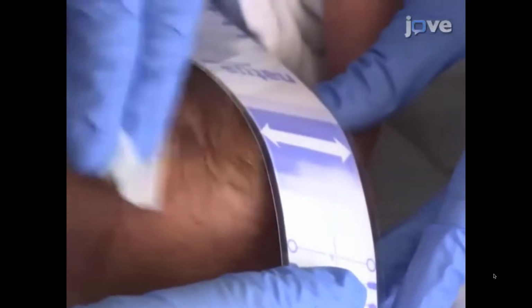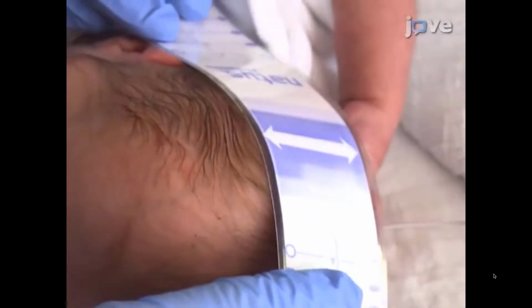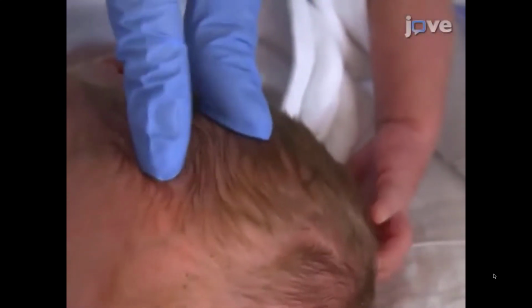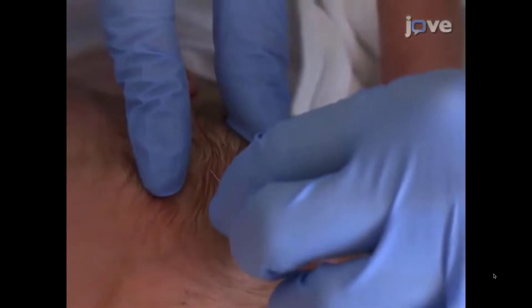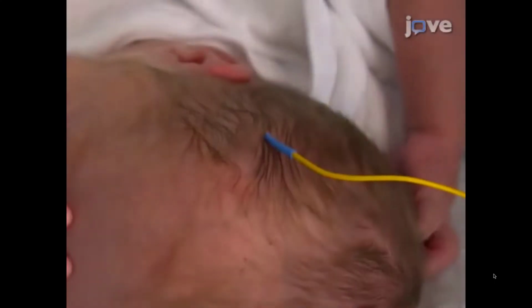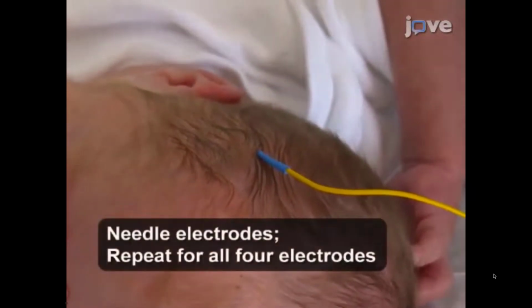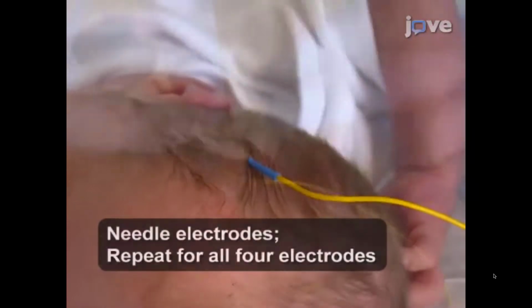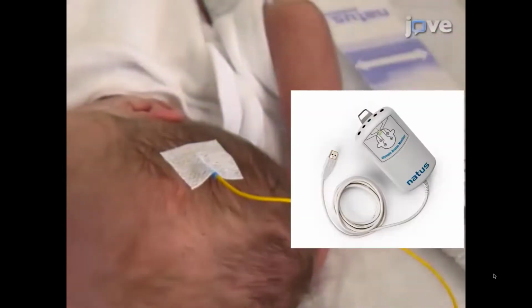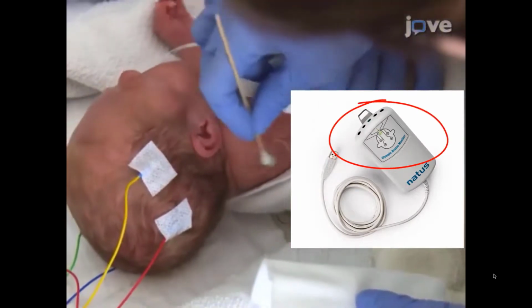Then, right before placing the remaining electrodes on the infant's head, disinfect the area indicated by the arrows on the measuring device. When using needle electrodes, stretch the skin slightly and insert the needle tangentially, just underneath the skin at the markings, with the tip of the needle pointing in the caudal direction. Use tape to keep the electrode in place. Next, insert the cables into the module box as indicated by the legend on the box.